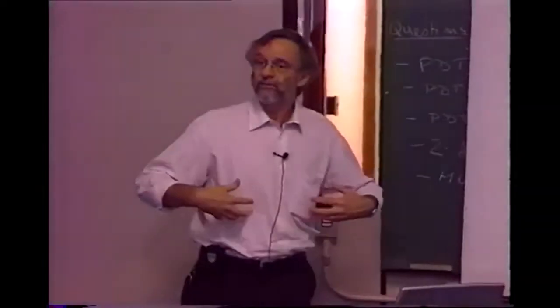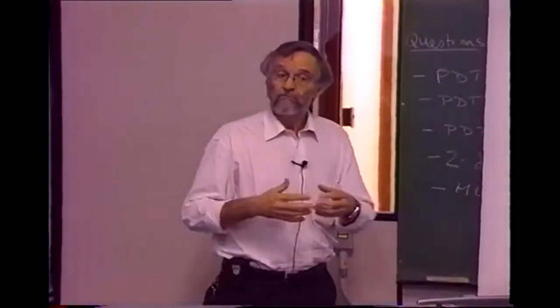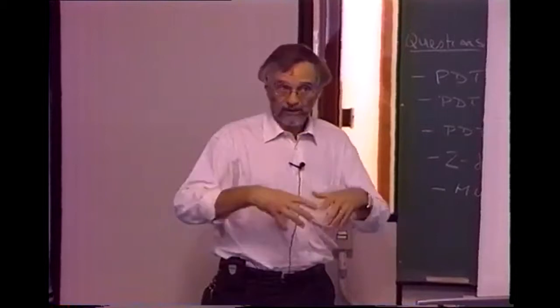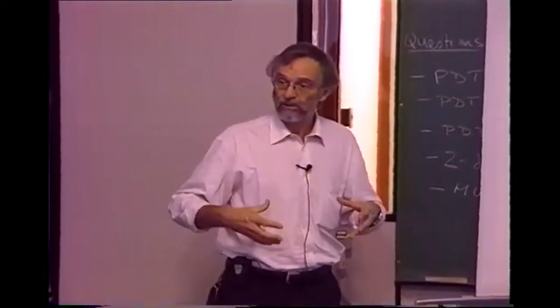Again, you have to think here, this is a very difficult situation because you have a very complex surface, and it's important to treat the whole of the surface. People often have tried filling the abdomen with intralipid, which is a light scattering material, so that you have a whole light scatter medium inside.